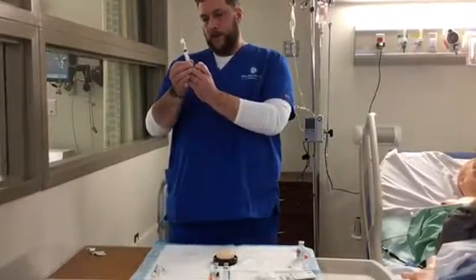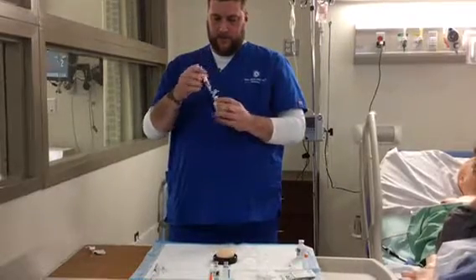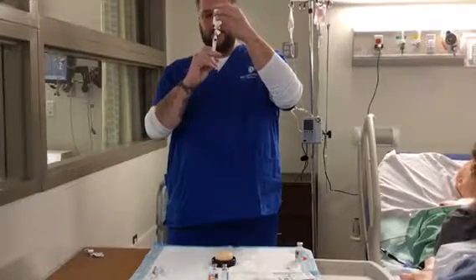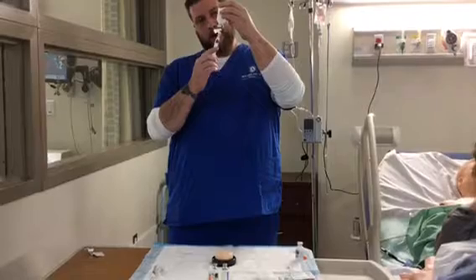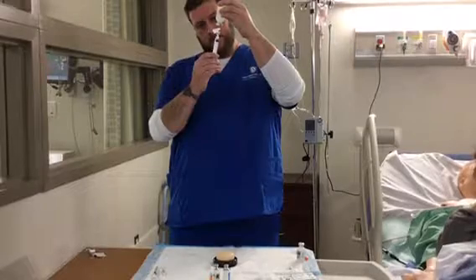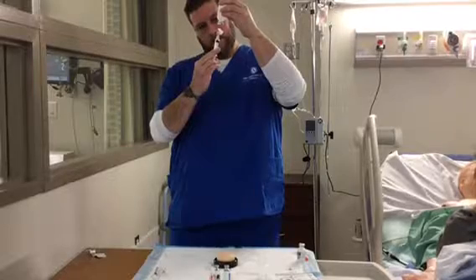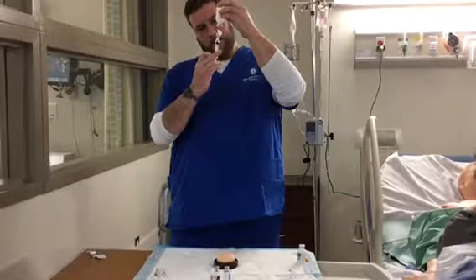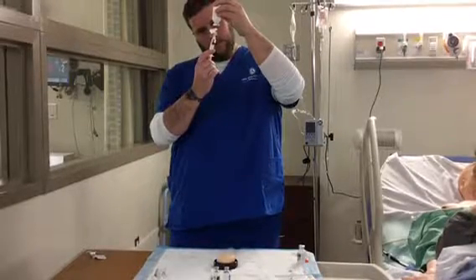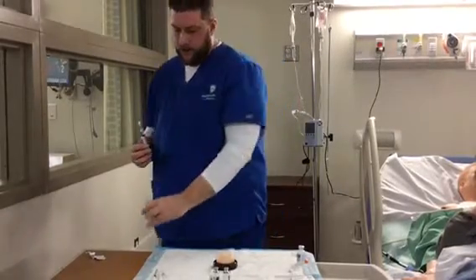You would withdraw 2 milliliters of air, insert into the vial, expel the 2 milliliters of air, and then withdraw the 2 milliliters, making sure not to get any air bubbles.